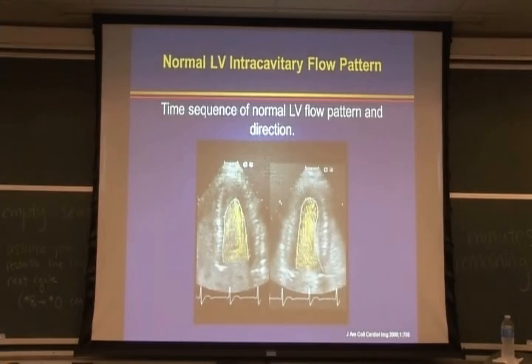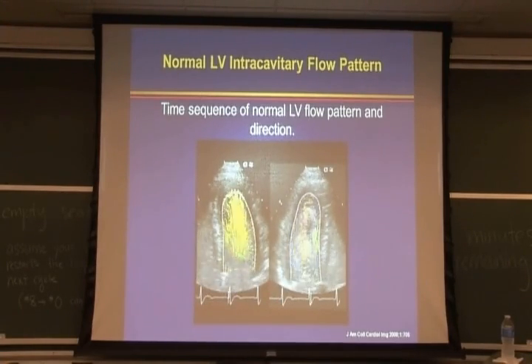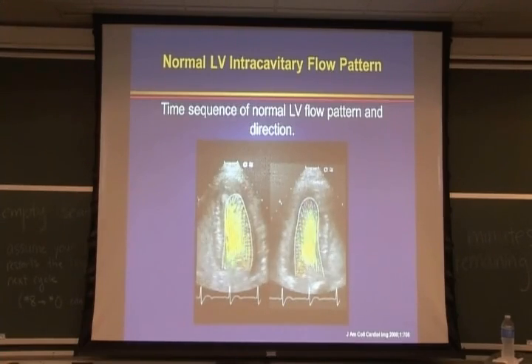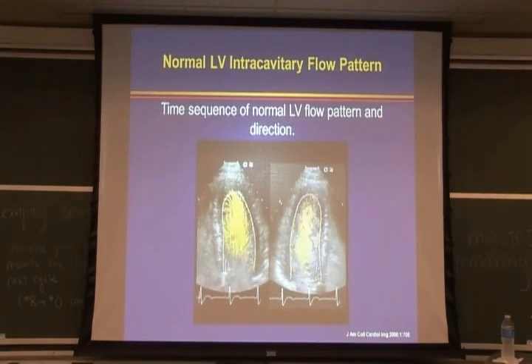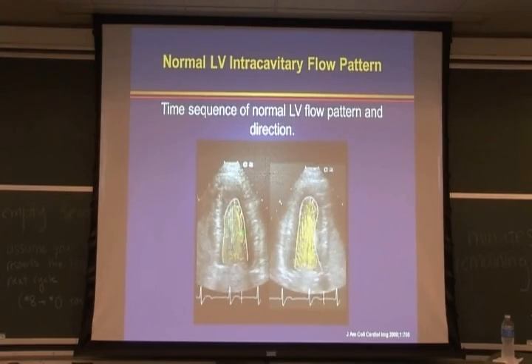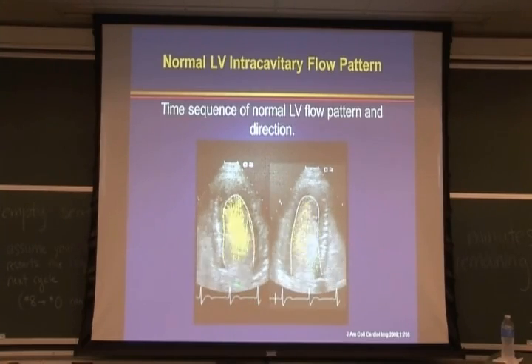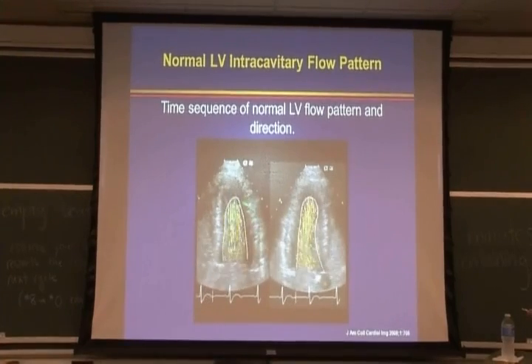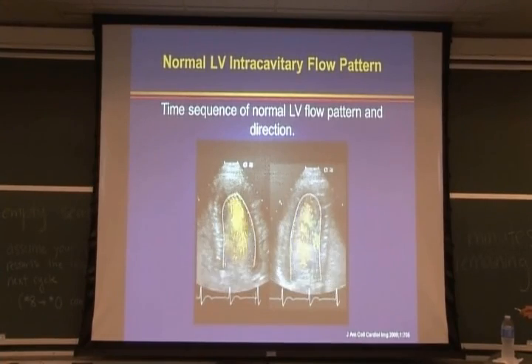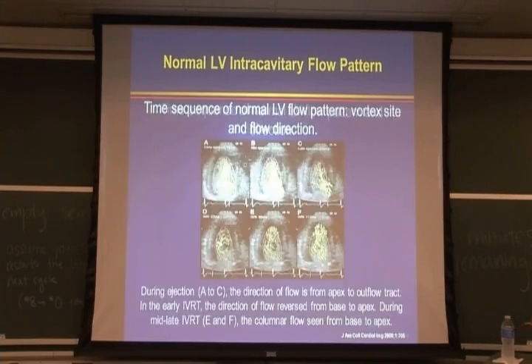If you track the individual blood flow, again by particle velocimetry, and provide the vector, meaning the direction as well as magnitude, which is depicted by the orientation of these arrows and their length, you can see the blood comes from the left upper chamber to the lower chamber, and then it goes out. In this case, the outflow tract is over here, and in this case, it's on this side. So it's swirling around, creating a vortex, in a very efficient manner.